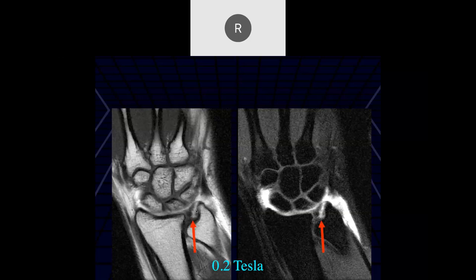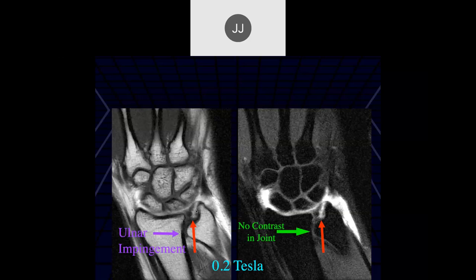What would you do with this case? I'd refer to a hand surgeon — most orthopedic surgeons wouldn't touch it. As you'll notice, the ulna is short and it's impinging. I don't think this can be fixed arthroscopically; you have to change the length of the ulna. That is a pretty tricky surgery — there are many different procedures and books written about them.